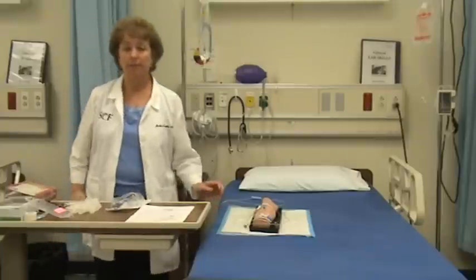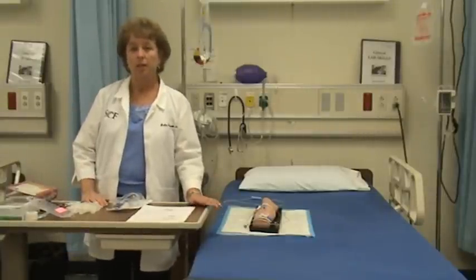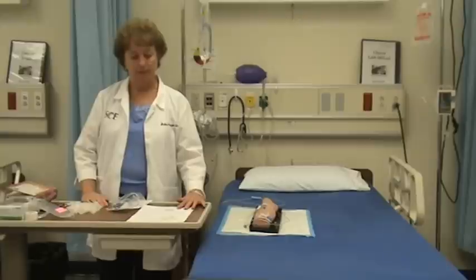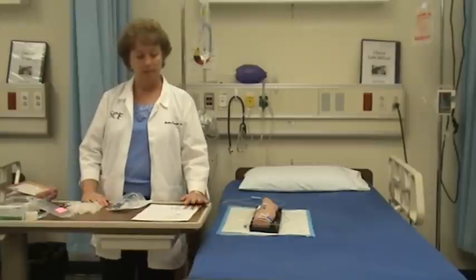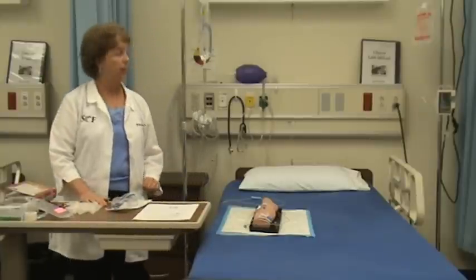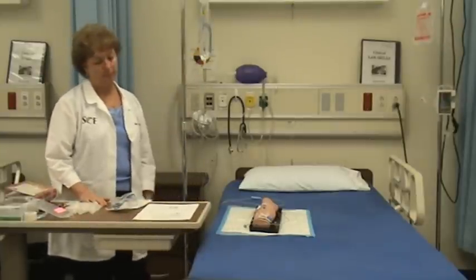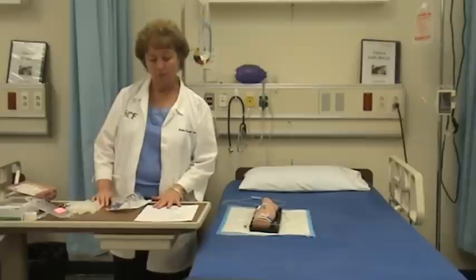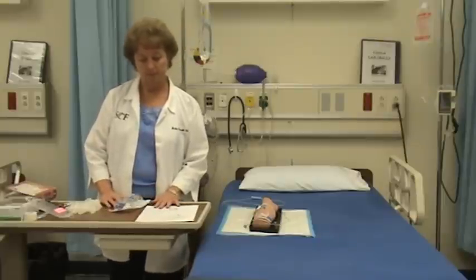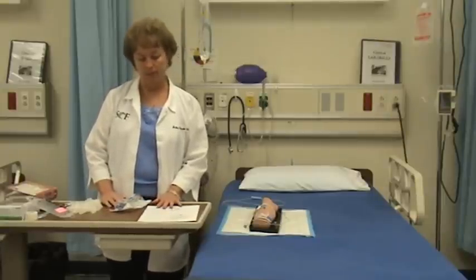I'm now going to demonstrate giving an IV piggyback medication when the patient has a running IV. The patient has an IV of 1000 mL half normal saline with 20 milliequivalents of KCL, and the order for the IV piggyback is for the patient to receive ampicillin 500 milligrams.